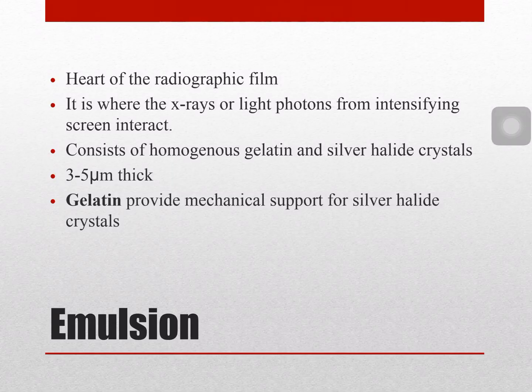Now, let's proceed with the emulsion. So, alam natin that the base of the film is its foundation. It has dimensional stability. Pag sinabi dimensional stability, kahit basain, kahit iwagayway, kahit baliin, it won't change its form. Our base is responsible for the structure of our entire film.